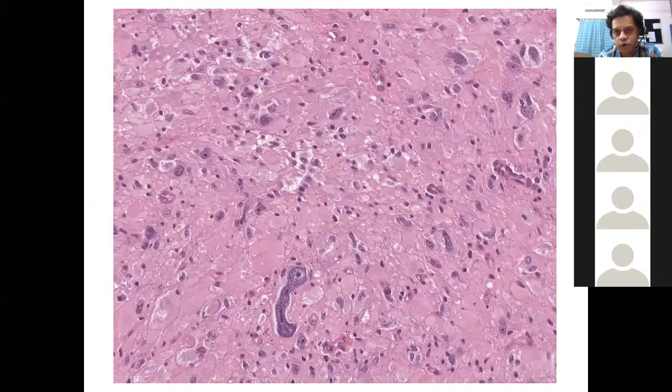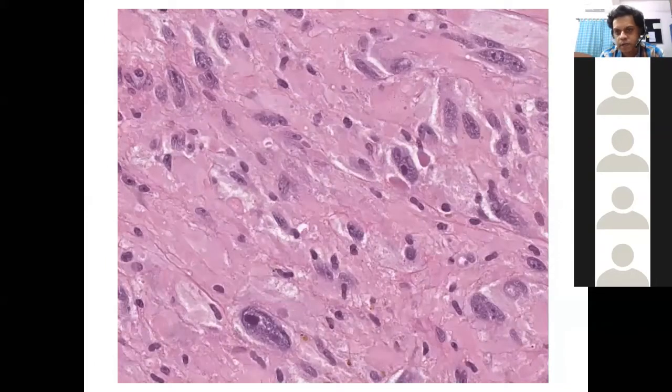So this is the thing that I was talking about. Sometimes these retroperitoneal schwannomas will show striking amounts of atypia. They will show bizarreness almost. So we need to take that in context. If we are having a tumor that fits the other points as far as the Schwannian nature is concerned, that is the Antoni B areas we are satisfied with, plus the S100 is giving us a characteristic pattern which is Schwannian, and all the other markers are negative, we can ascribe these things to an ancient change basically. So this atypia, this kind of bizarreness is nothing worrisome. You just don't expect to see mitosis in that background. If on top of this bizarreness you start to get mitosis, then you start to get worried whether you are missing out on any other soft tissue sarcoma basically.